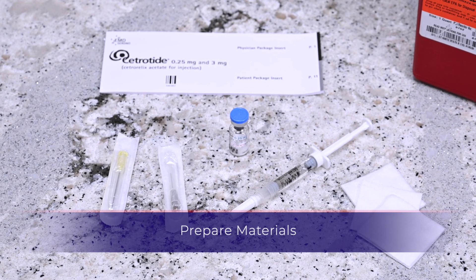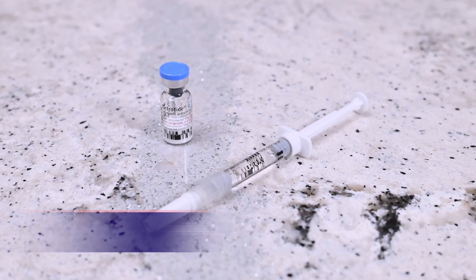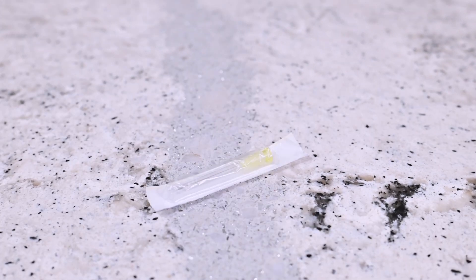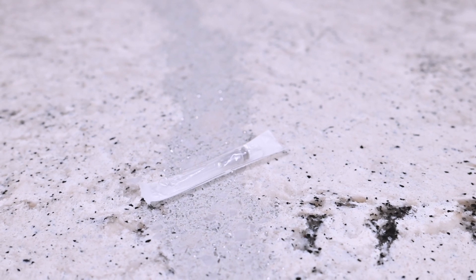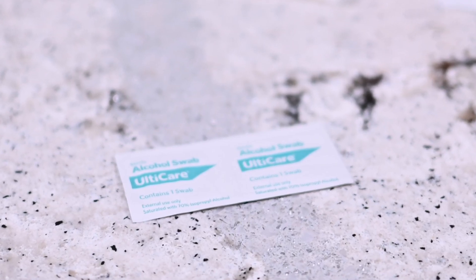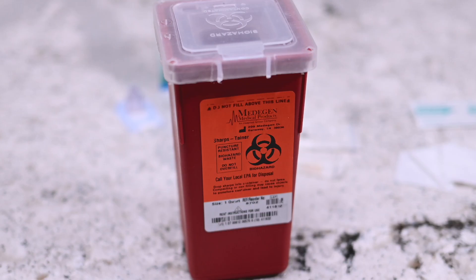You will need the following: a vial of Citratide powder, a syringe labeled sterile water, a 20 gauge one and a half inch needle for mixing, a 27 gauge three-fourth inch needle for injection, an alcohol prep wipe, sterile gauze, and a sharps container.